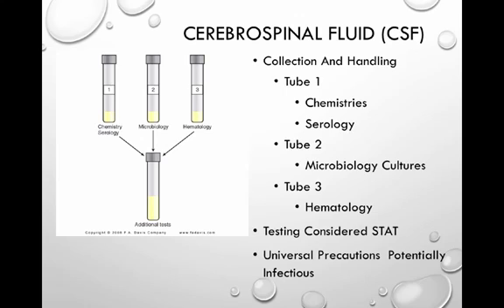So the goal is to have the hematology be the last sample that's removed, so that cells that present within the tube can definitely be said to have come from the spinal canal and not the result of a traumatic tap.